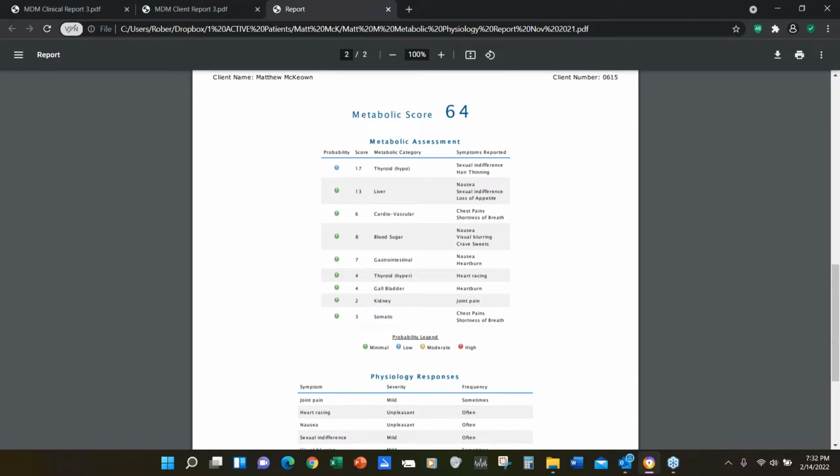I agree. I actually go over all the things you've all discussed, but I'll also say to them that some of this may show up in the map. So I'll pay attention, and I'll say you indicated blood sugar, and that may show up in the map. And then I point that out to them. Or if they come up with a lot of adrenal stuff, I say you may have adrenal fatigue, and that may show up in the map. And so I try to correlate a little bit of how the physiology could show up in the map from the standpoint of their brain function, so they understand there is a body-mind connection. And, of course, then I encourage them to go take this to the doctor.